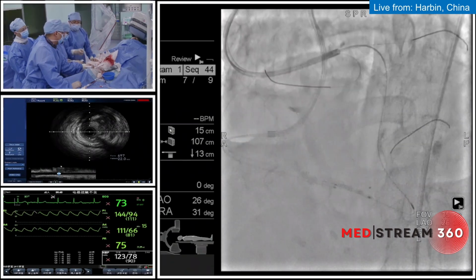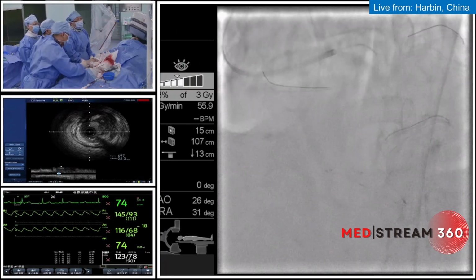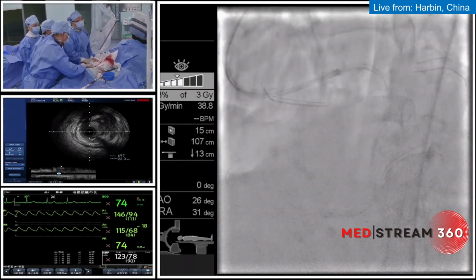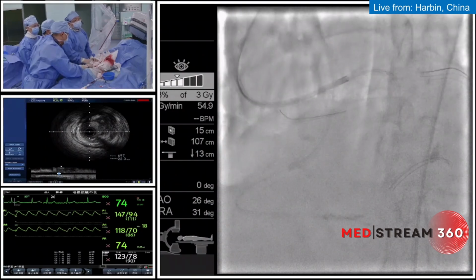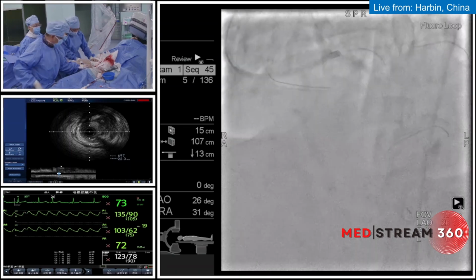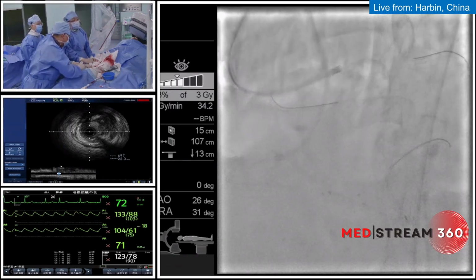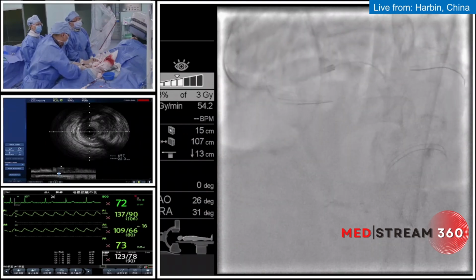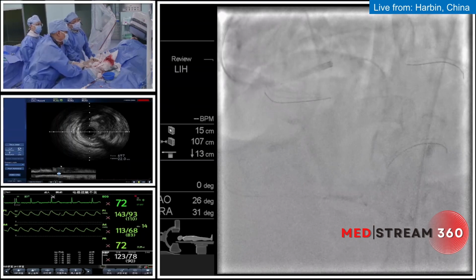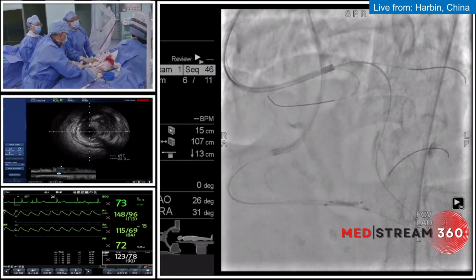Okay, judged from the previous IVUS run, we can see that the PLV branch is relatively small in diameter, at least currently, and the lumen diameter is 2.0 millimeter, and the PDA branch is relatively a little bit bigger. Inflation simultaneously. And also checking from the IVUS, we can see another small bifurcation joining into the main vessel.